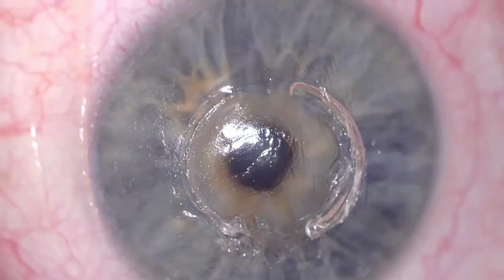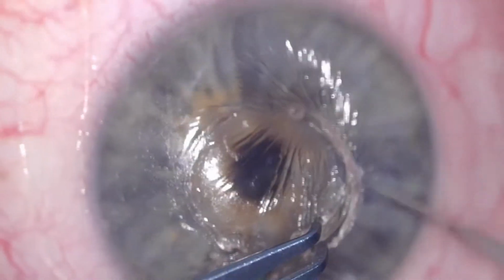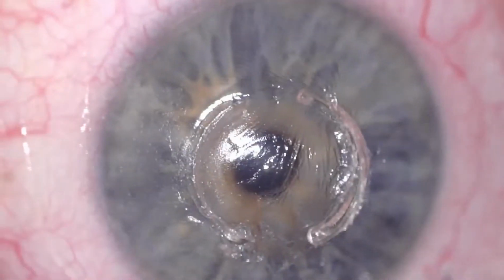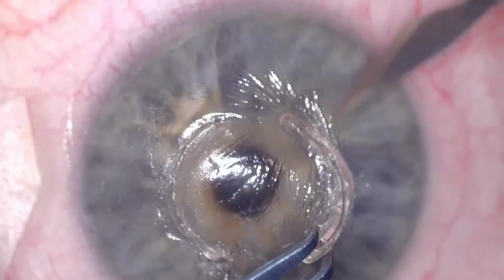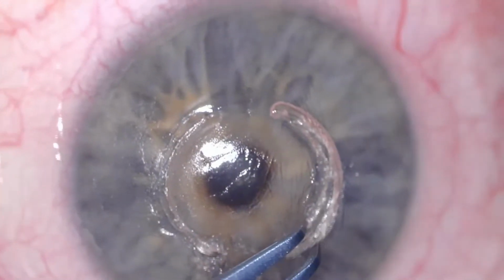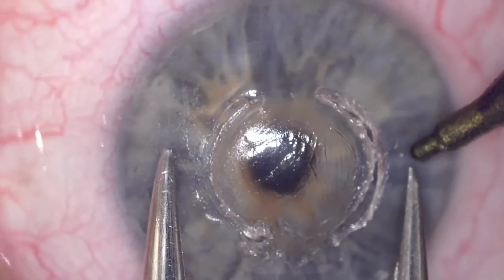and so we decided together to carry out a deep anterior lamellar keratoplasty. Here you can see me removing the intrastromal rings. It's not so essential that you take the rings out through the preformed tunnel. I did that with the first ring, I just pulled it out with a Sinskey, but here it is a bit more resistant, so I'll just cut the anterior stroma above the ring, being careful not to perforate the cornea. And now I'm just pulling it out through that opening from the anterior stroma.